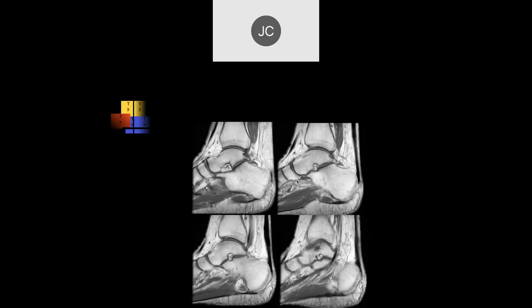The tibialis anterior tendon comes down obliquely — not in the straight sagittal plane — and inserts distally, usually involving the medial cuneiform. Here's the talus, the navicular, and the medial cuneiform where it attaches. You can see it go proximally and laterally up close to the midline.